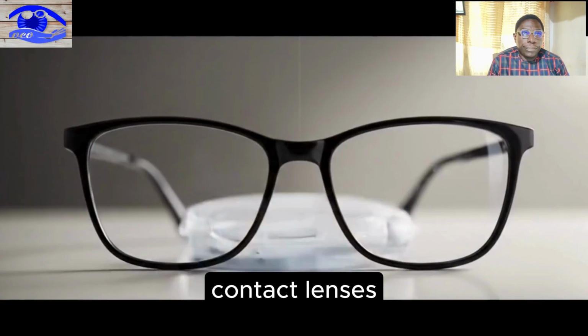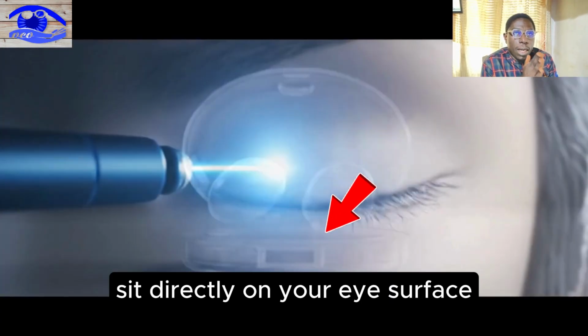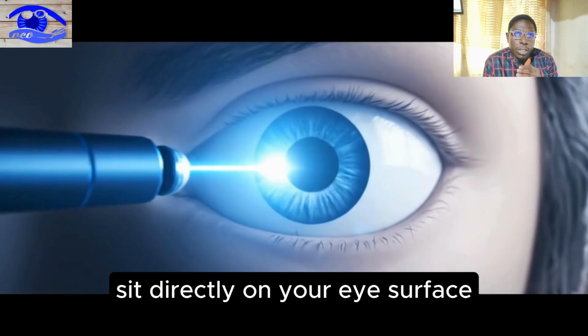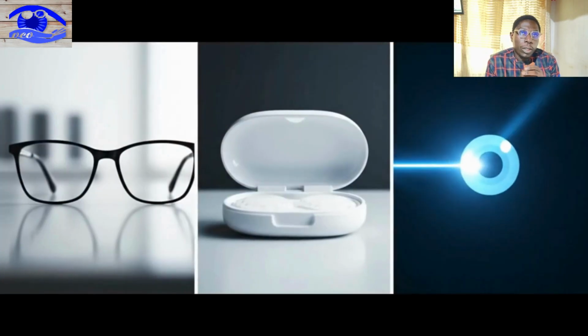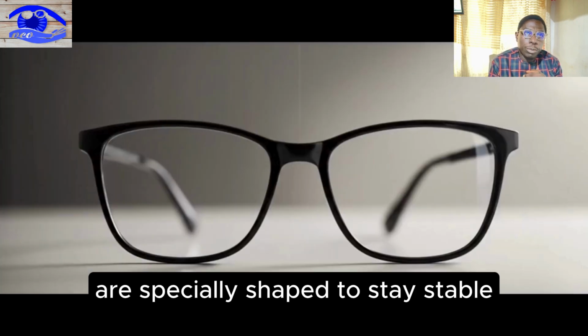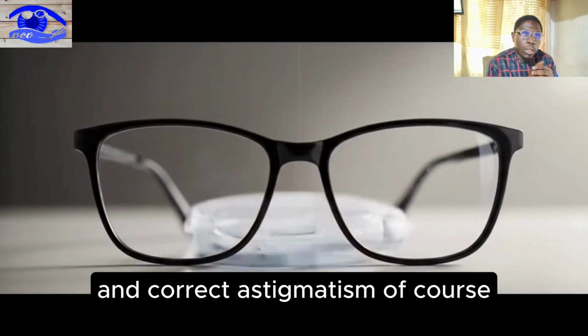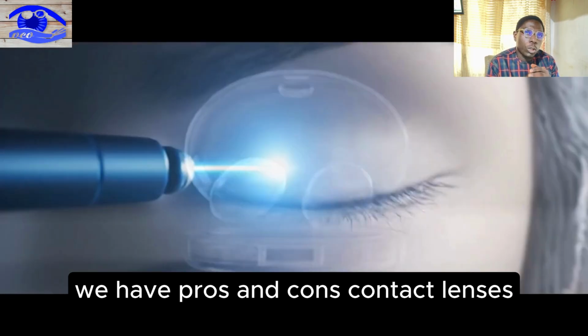contact lenses. This type of lenses sit directly on your eye surface for a natural field of vision. Toric contact lenses are specially shaped to stay stable and correct astigmatism. Of course, we have pros and cons.